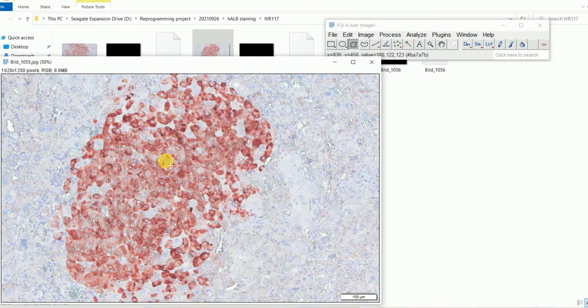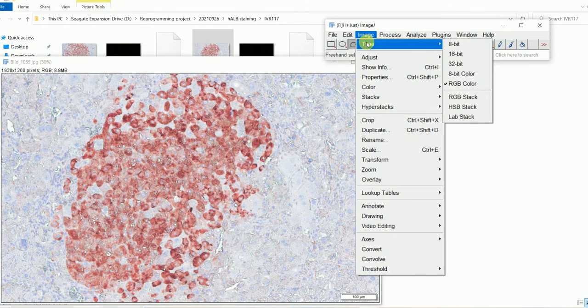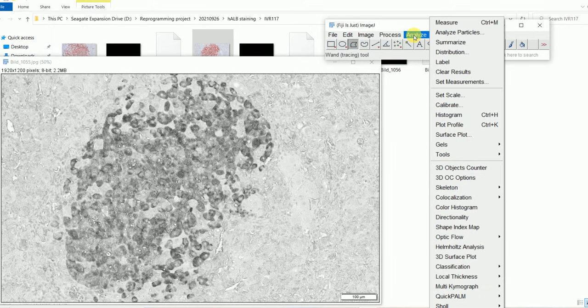Okay, so to quantify this area, first I have to go to Image, and then I have to convert this image into an 8-bit image. Okay, so now this image has been converted into an 8-bit image. After this, or before this also, you can go to Analyze and then go to Set Measurements.